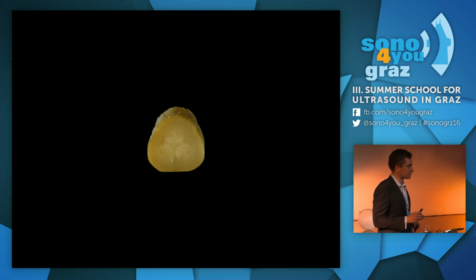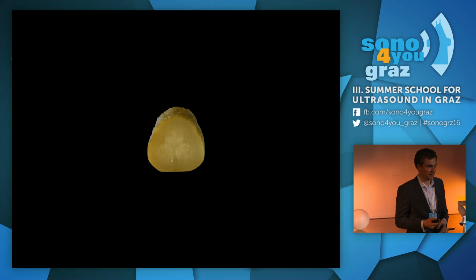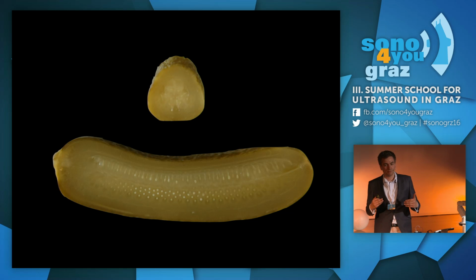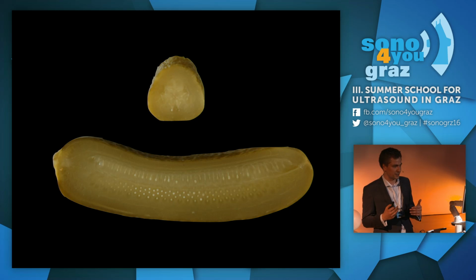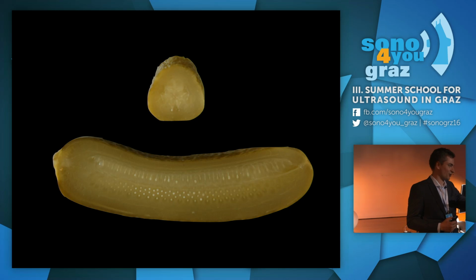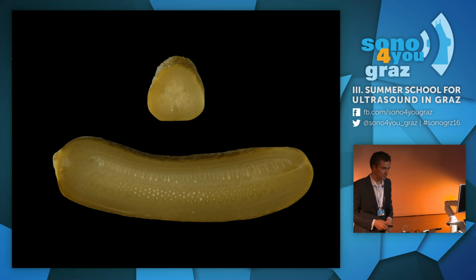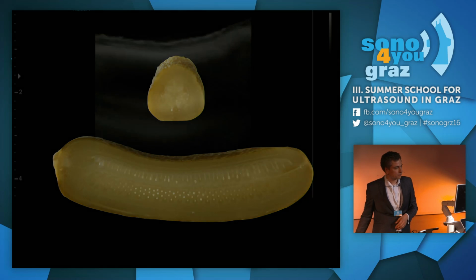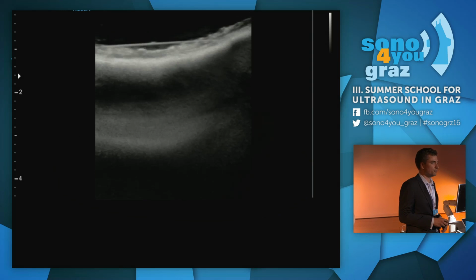But definitely by this one image you can't tell what it's really like. You need a second plane to actually tell in an ultrasound what the structure is. And somebody said somewhere around there it's an Essiggurkerl. Yeah, definitely, it was a cucumber. And you can ultrasound a cucumber, but you definitely need the two images, the two planes.